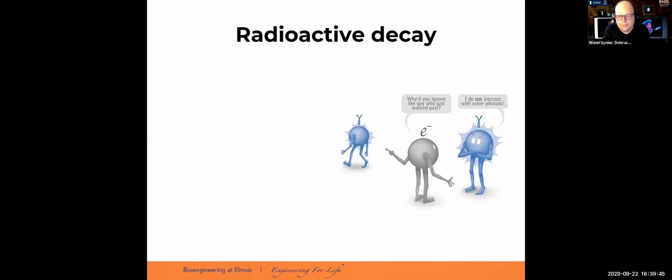All right, so now we start talking about detection of the products of radioactive decay. And this is an anecdotal story: there is an electron and a gamma particle, and the electron says to the gamma particle, why would you ignore the guy who just walked past? And the gamma says, well, I do not interact with other protons. I'm sorry, other photons. And it's true. There is no interaction between the photons, but there is interaction between other particles.